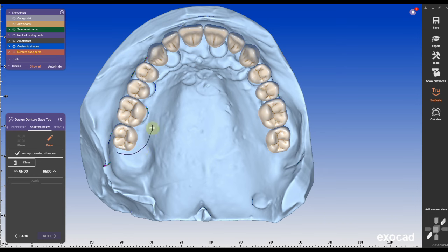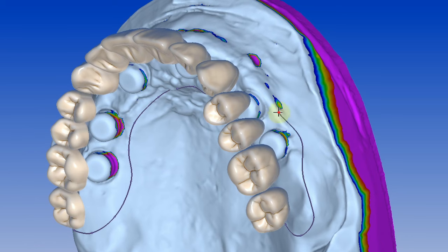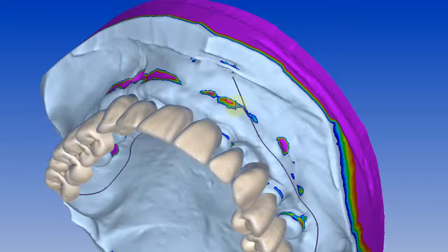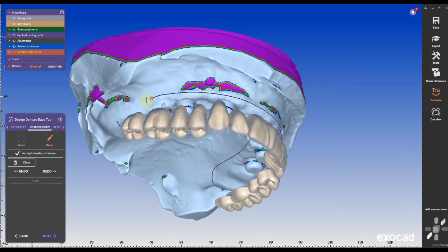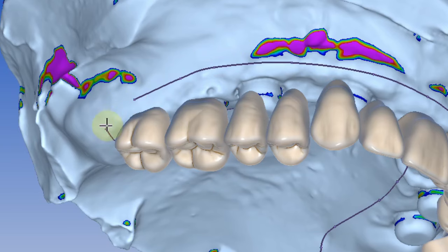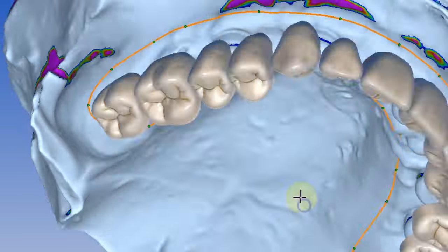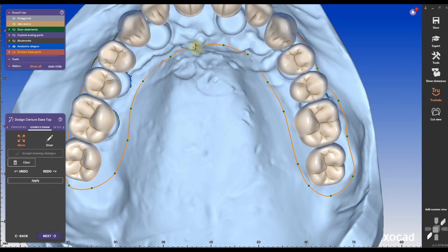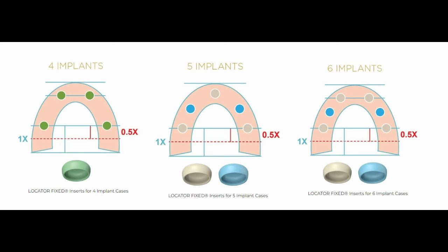This new system was developed by Zest and you need at least four fully osseointegrated implants. The AP spread is listed for 1x for regular bites and 0.5x for bruxers.